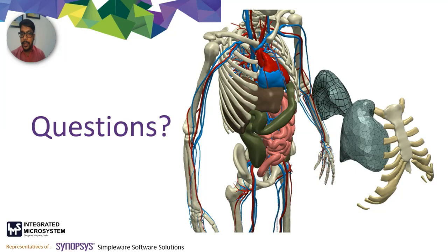As most of the participants here are mostly related to 3D printing and the orthopedic application area, I would suggest that you have a look at the software. We are also presenting the software in our booth. We also have a booth in this presentation, so you can come over to our booth to have a look at the software. And if you provide us some time, we can later on also schedule an online demonstration with you to showcase our software and whatever capabilities are available, and how this software can be beneficial over other software that are currently available in the market.